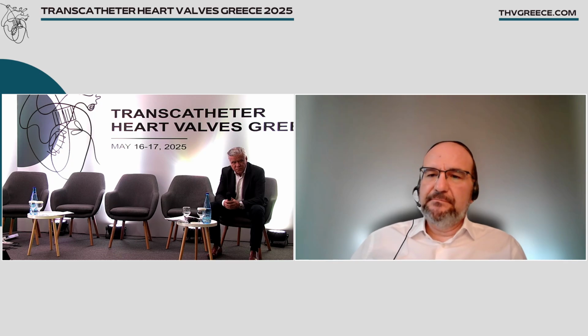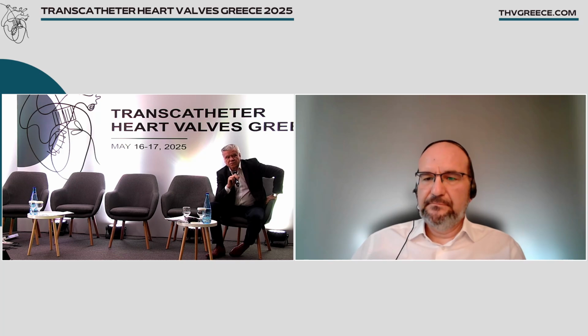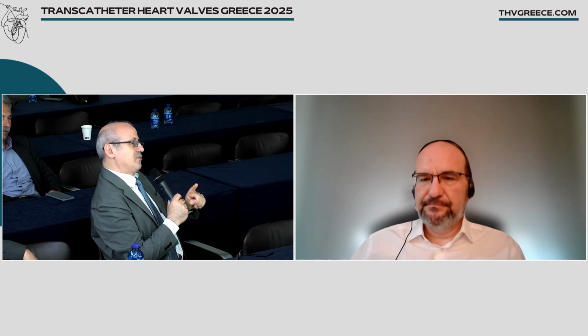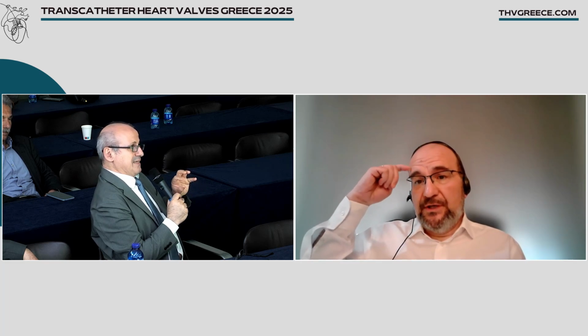The only problem I see is that this is an excellent result of what we're going to do more and more over the next years, because there are a lot of self-expandable valves and supra-annular valves around that in the future we'll have to do this very often. The only downside is that if you have to go into that left main for coronary intervention, that would be extremely difficult, if not impossible. So that's the only problem I see.